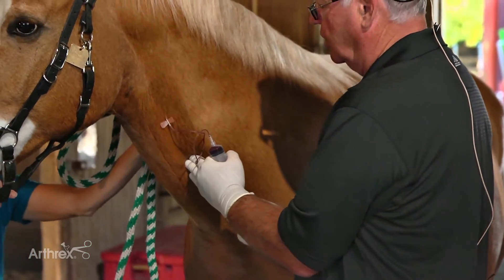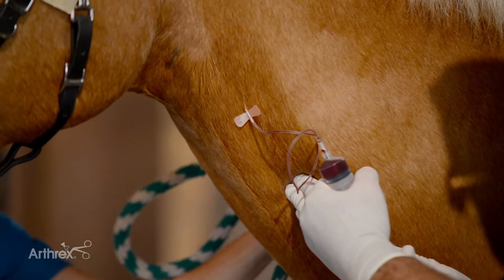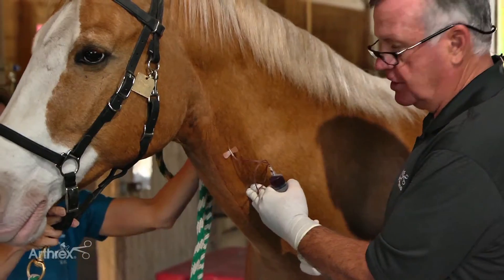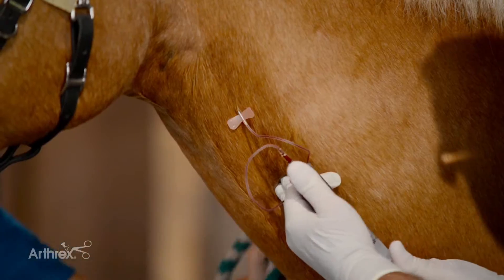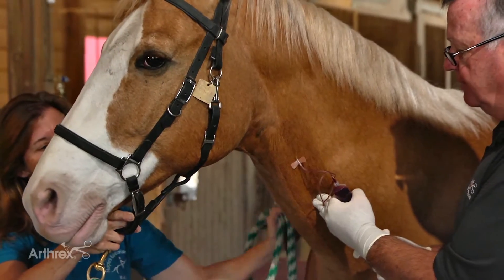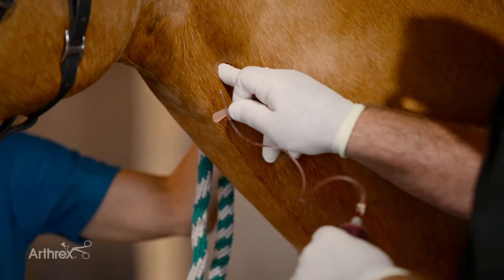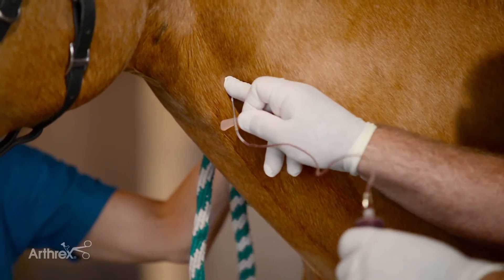What we want to do is keep the jugular distended during the whole process so that the needle doesn't suck up on the side of the jugular vein, and we also draw the blood out at a reasonable but not fast rate. We want to be conscious of not causing hemolysis. Just remove the needle and hold off the jugular for a while so we don't get a hematoma.